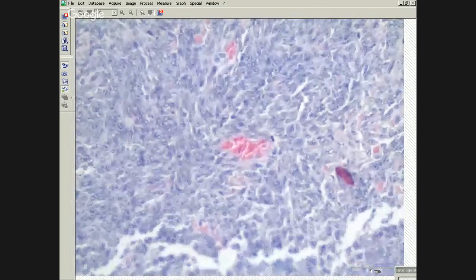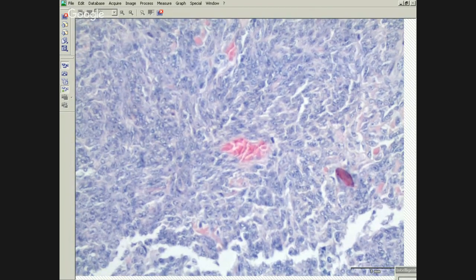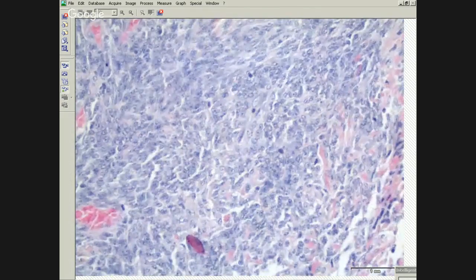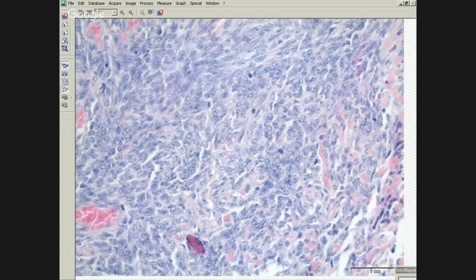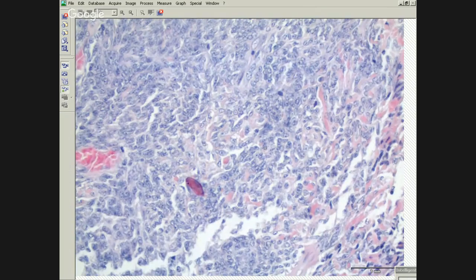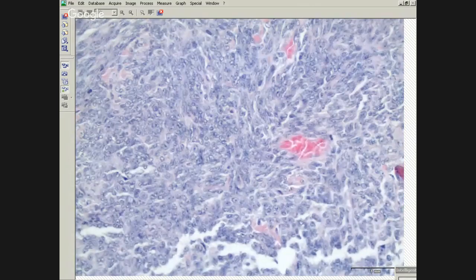Now this tumor can present as a primary pleural lesion, either as a localized mass or as multiple nodules or diffuse pleural thickening. Or it could be metastatic from someplace else. Synovial sarcoma? Very good. Okay, so this is another one where you want to get your keratin. Depending on your sample, it's going to be hard to demonstrate keratin staining. Maybe you're just going to get a few cells, but it's not going to have diffuse keratin staining. So this is a synovial sarcoma.